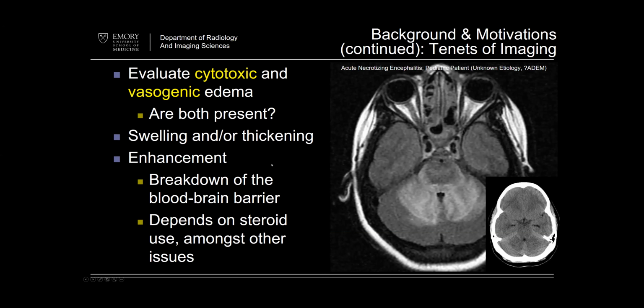Enhancement is a very blunt instrument. It's just simply breakdown of the blood-brain barrier. It depends, it can be affected by a whole lot of things, including corticosteroid use, amongst others. So it's a very blunt instrument, but of course everybody kind of follows it.